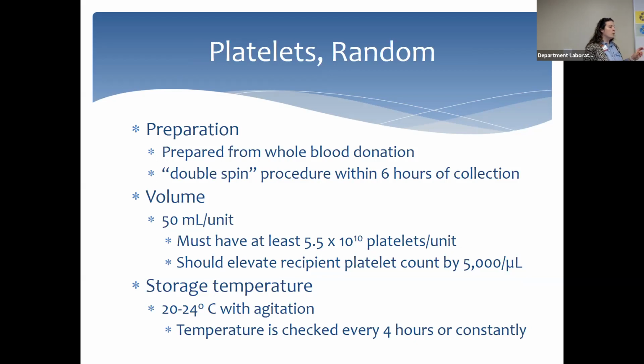And so then, if we have a sample, we could receive a sample on that unknown patient, and then we could use that sample to cross-match units and do his testing on. Then once we know his name, we have to update our records.